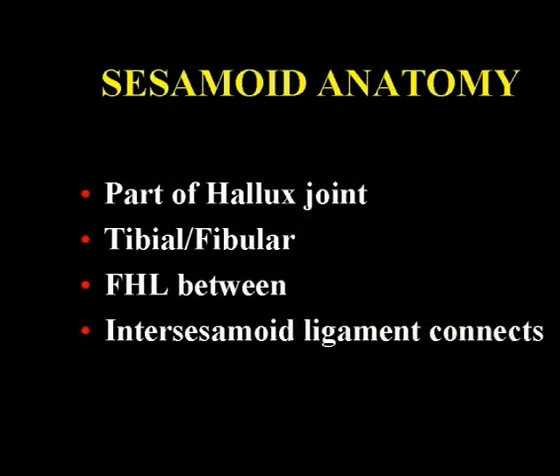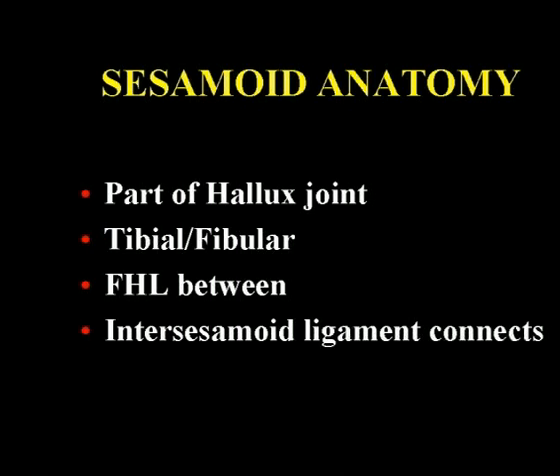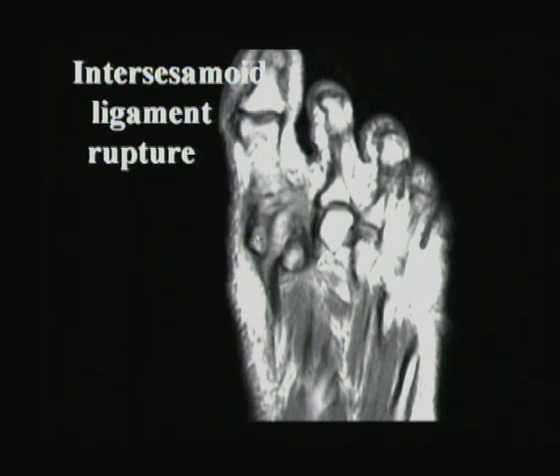Rather than saying medial and lateral sesamoids, the preferred term is tibial and fibular. Attaching the sesamoids is an intersesamoid ligament. Between the sesamoids on the metatarsal head is a small spicule of bone called the crista, and plantar to the sesamoids lies the flexor hallucis longus. In this professional football player, the FHL has bulged up, separating the tibial from the fibular sesamoid due to an intersesamoid ligament rupture. In hallux valgus, the two sesamoids almost always shift as a unit; when they do not, that's an intersesamoid ligament rupture.